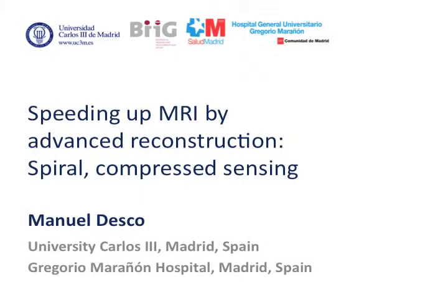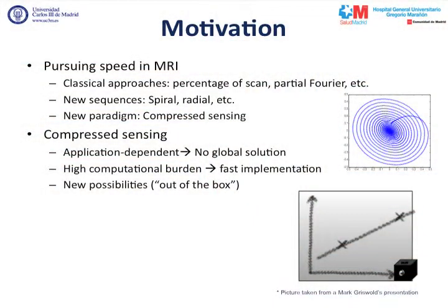Good morning again. This is a much easier project than the one I explained before. In this case, the idea is that, as you perfectly know, the increase of acquisition speed in MRI is one of the holy grails in this area since the very beginning.